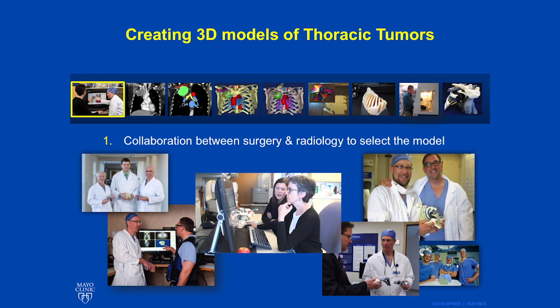Collaboration is the key to creating relevant models. Surgeons planning complex multidisciplinary interventions may have specific organs or structures they want to include or exclude from a model. It is during this time that the radiology team and intervention team begin the process of creating the 3D model.